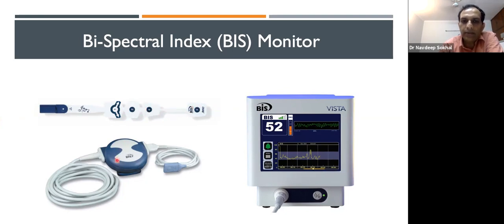And this is a unit which actually processes the EEG signals. This end is connected to the sensor here, and this end is connected to the machine here, and the screen displays the values.